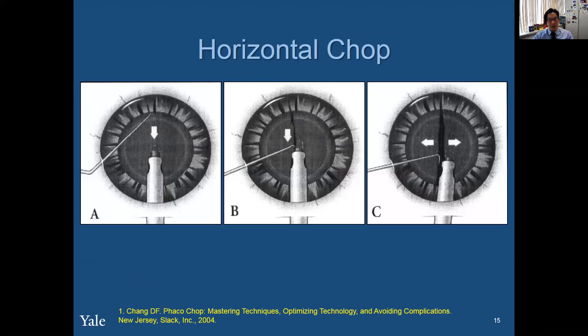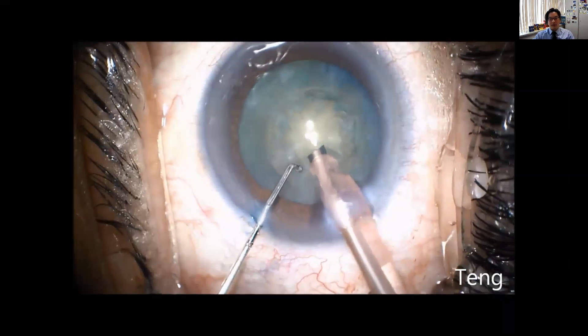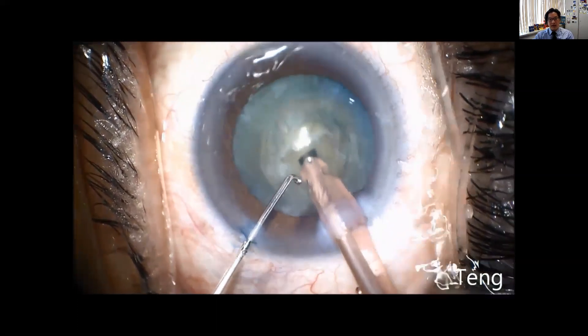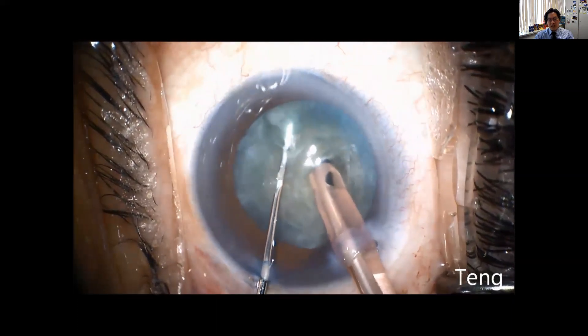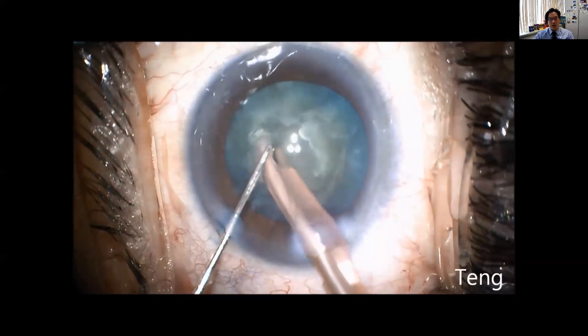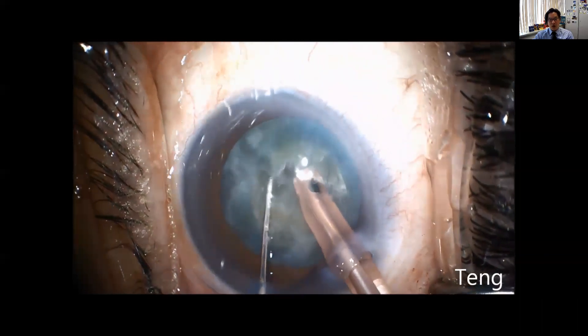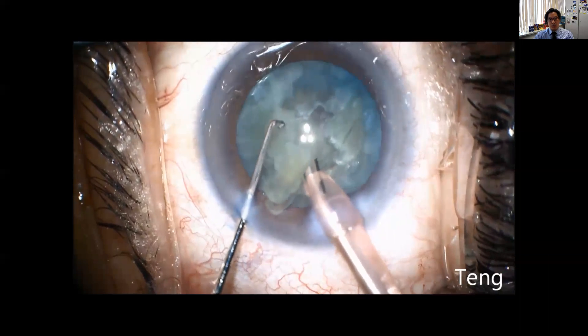This is from David Chang's chop book. In horizontal chop, you're moving the second instrument against the FACO piece and then moving it out to create the chop. First, you want to shave off the top layer of the softer cortical material. Then you dig a little bit of a hole to maintain counter traction of the second instrument. At this point, I'm not stepping down on my foot pedal — I'm just moving my second instrument out under the rhexis and over the side of the piece, then pushing it towards the FACO handpiece, which is serving as counter traction. This is like a sawing motion — a compressive force moving the instruments together.